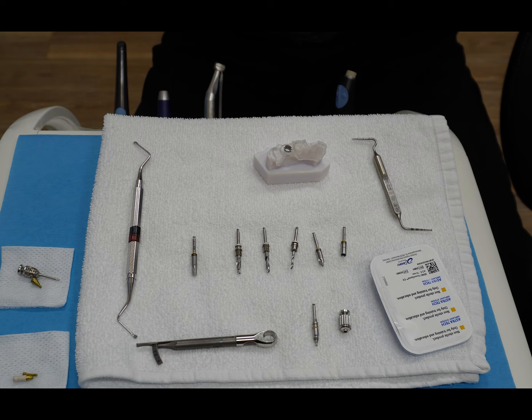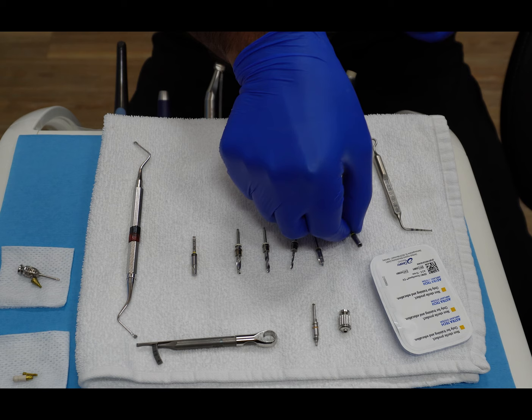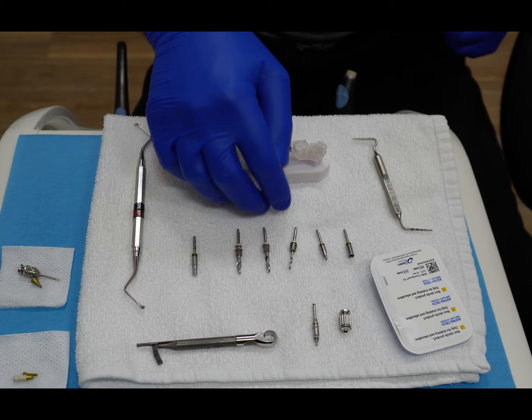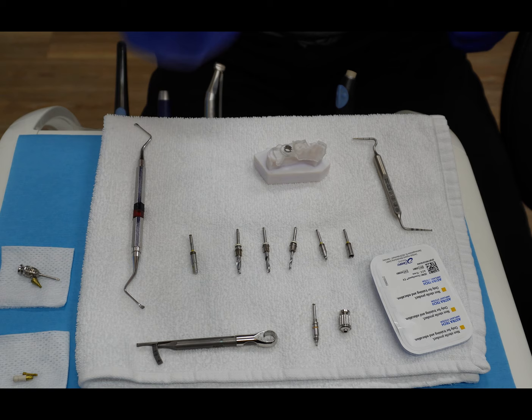Obviously this is not a real patient so I have a towel here as we'll be spraying saline — normally this would be on a sterile surgical kit with drapery. Going through our armamentarium: we have the tissue punch appropriate for the size of the implant, a curette for reflection of residual tissue, our initial cortical burr, then a sequence of osteotomy burrs finishing for the 4.2C Astra implant, then our final finishing cortical burr. We have our implant driver with the hand attachment and the corresponding torque wrench.